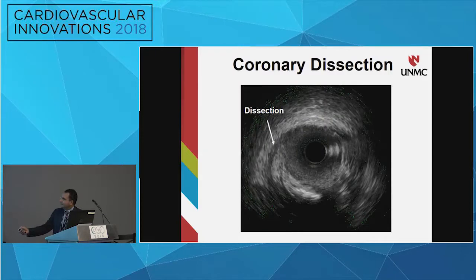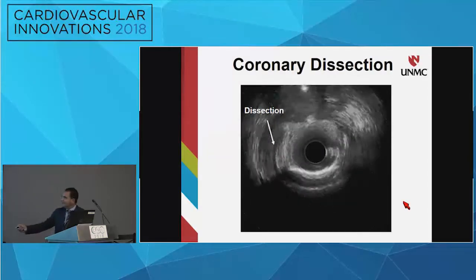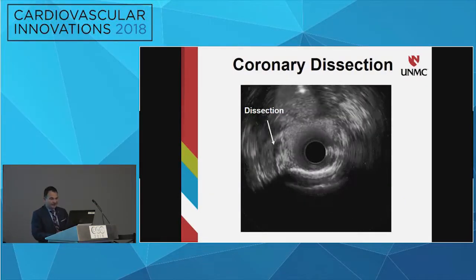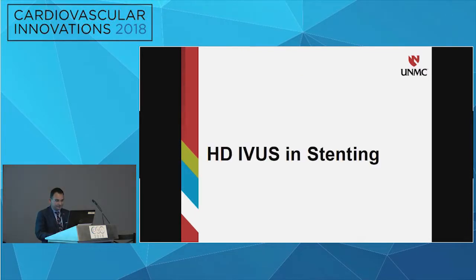Dissection. So very nicely, you can appreciate the intimal flap here and entry of blood into the area under the intima, just at the take-off of this branch.